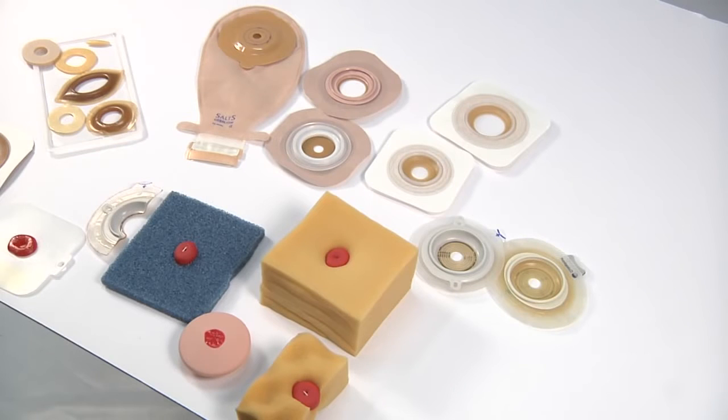We are going to review commonly available convexity, their individual merits and concerns, and it's important to note that there's no universal language for describing or grading convexity. Most descriptors come from clinician experience. We're going to look at whether it's pre-cut or cut to fit or moldable. We're going to look at whether it is integrated or non-integrated. We're going to talk about the amount of tension that's applied to the peristomal plane, and we're going to look at varying depths of the convexity.